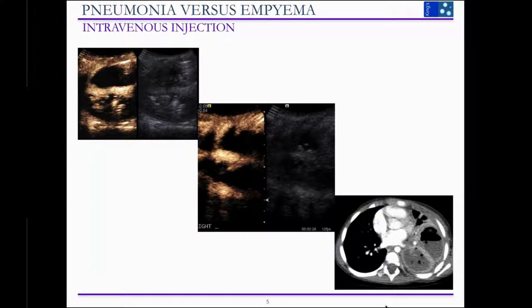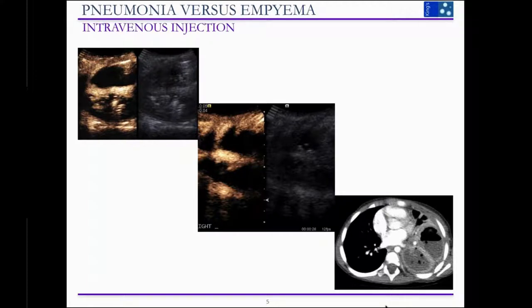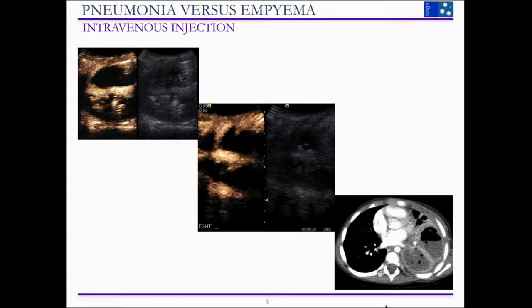This particular child had the contrast ultrasound performed after the CT, seen in the bottom right corner, which also didn't really add much — you have very thick-walled, enhancing, air-containing spaces and it was difficult to differentiate on CT which was empyema and which was necrotic lung. This was one of the first cases where we used IV SonoVue to differentiate lung pathology from pleural pathology. You certainly don't want to stick drains into a necrotizing pneumonia, as you risk developing bronchopleural fistulae.